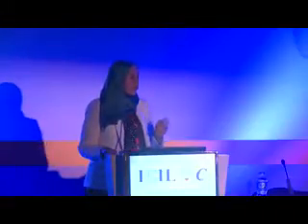You are totally right, but as we mentioned earlier, the prostatic tumors are multifocal. So if he was proved by the TRUS biopsy to have a single lesion, I can assess whether other lesions are prostatic tumors as well, or just inflammatory states or mimickers of prostatic cancer.